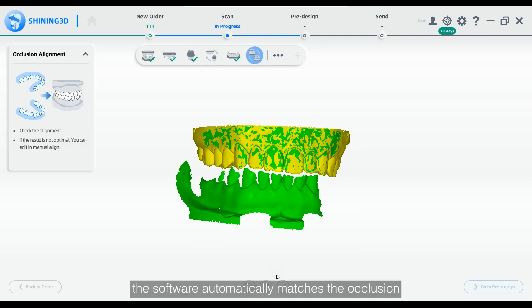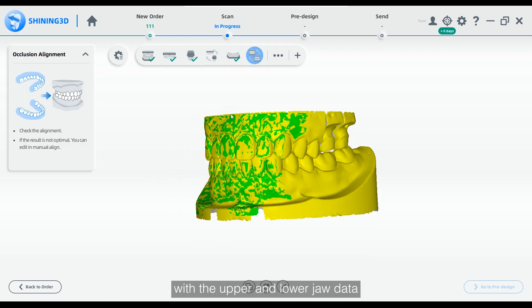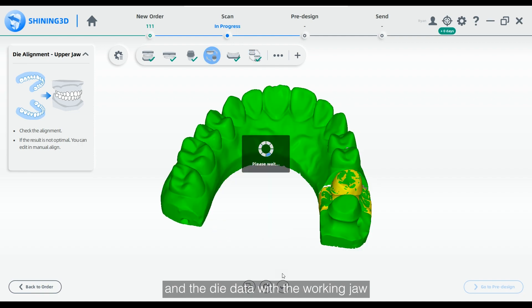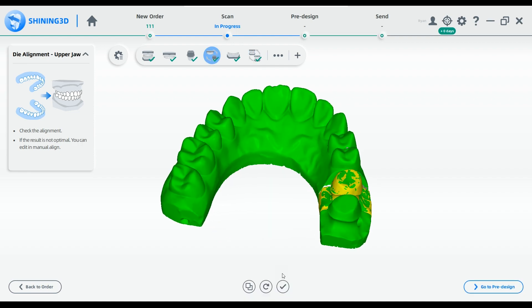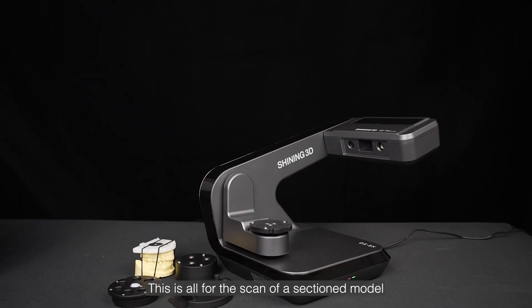After scanning, the software automatically matches the occlusion with the upper and lower jaw data, and the die data with the working jaw. This is all for the scan of a sectioned model.